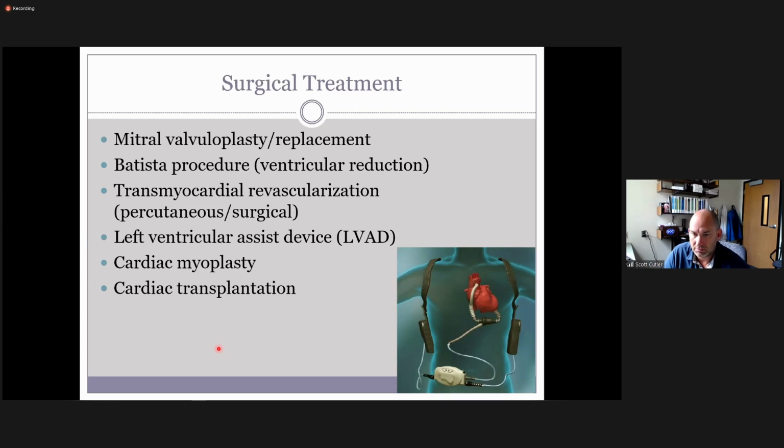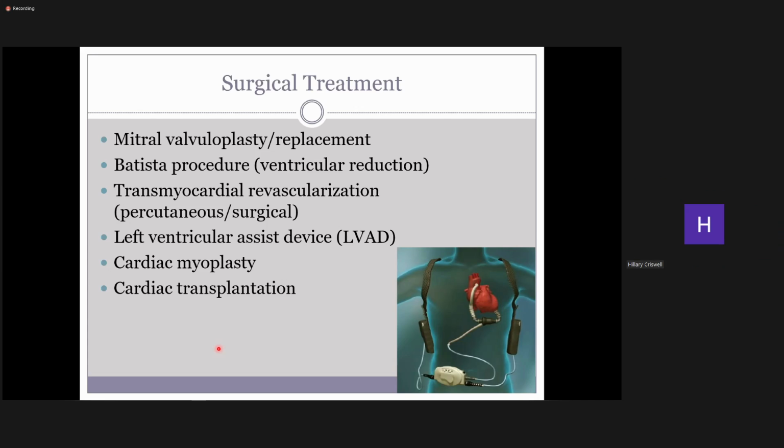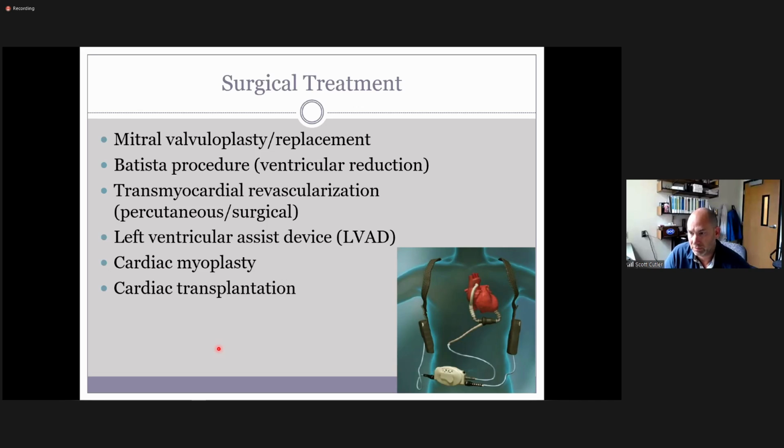Ejection fraction from your biplane. Okay. So ejection fraction is going to do two things. It's going to show us the volume, but it's also going to show us the ejection fraction. So it's comparing the systole and diastole, and both of those are important in this case. Good. So Simpson's biplane, we definitely want to do that from a couple different planes. What other measurements could we do? Wall thickness and inner diameter. Okay, good.